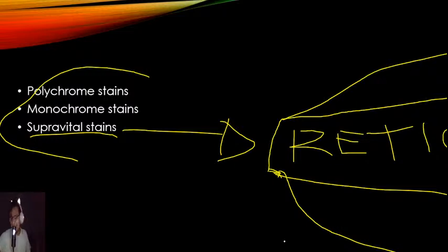Natandaan yung klase yung blast. Lagi na sa dulo yun. Lagi na sa simula yun. Actually, sasabihin ko pa lang sana. Buti yung sinabi mo na. Pag polychromatophilic normoblast, mas nauuna siya. Okay? Laging nasa dulo. Pagka polychromatophilic normocyte, yun yung malapit nang maging mature. Okay? Tandaan nyo lang yun. Huwag nyo kakalimutan, guys. Parang awa nyo na.